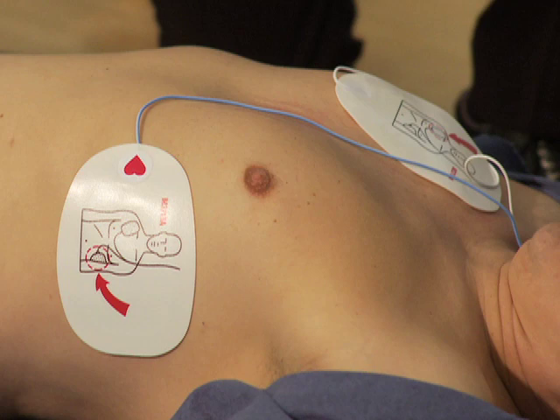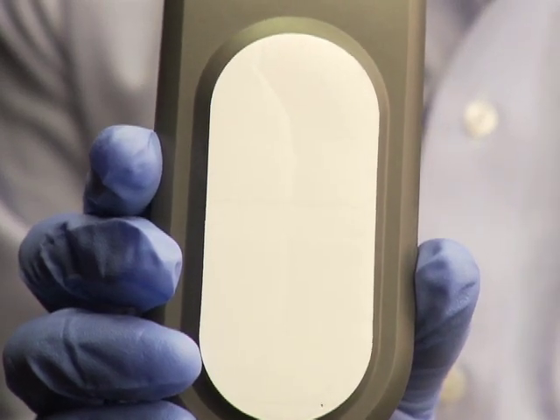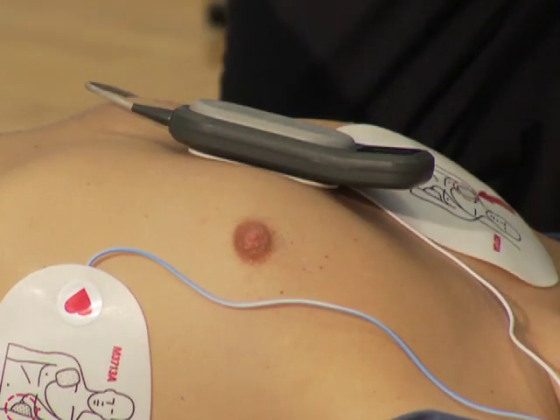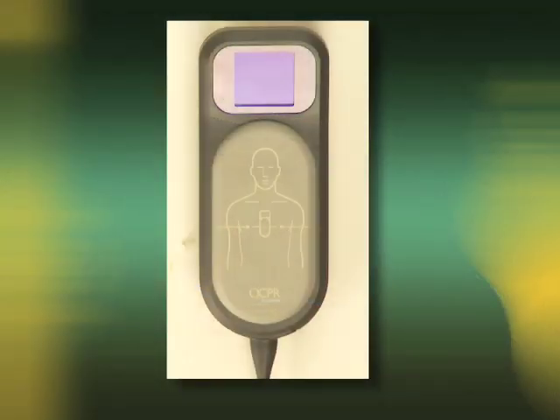Next, peel the green liner away from the CPR meter patient adhesive. Position the CPR meter on the patient so that the compression area is centered between the nipples and on the center line of the bare chest, as shown on the front of the CPR meter.